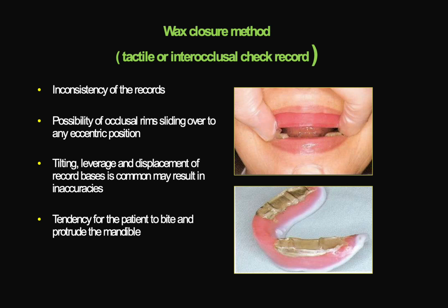There can be tilting, leverage or displacement of the record basis, which is very common with this technique, thereby resulting in more amount of inaccuracies. There is always a tendency for the patient to bite and protrude the mandible.